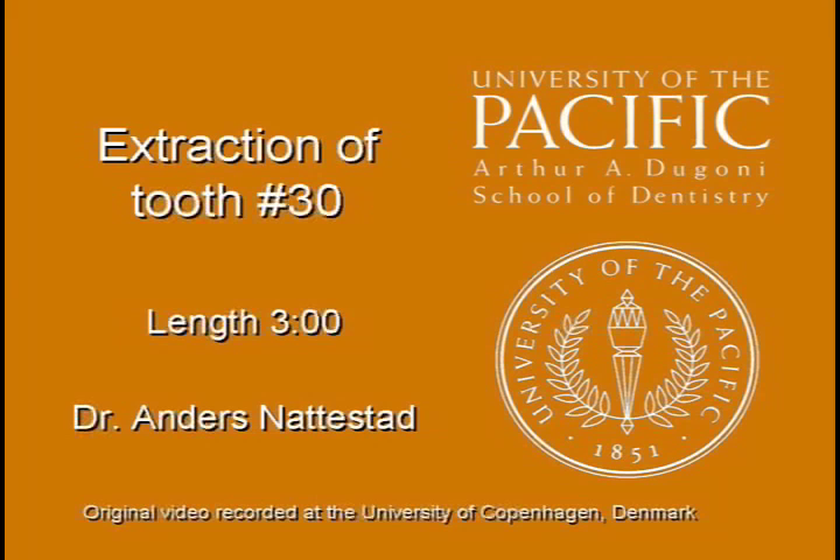This video illustrates the extraction of tooth number 30. It is a copyrighted production from the Arthur A. Dugoni School of Dentistry at the University of the Pacific, San Francisco.